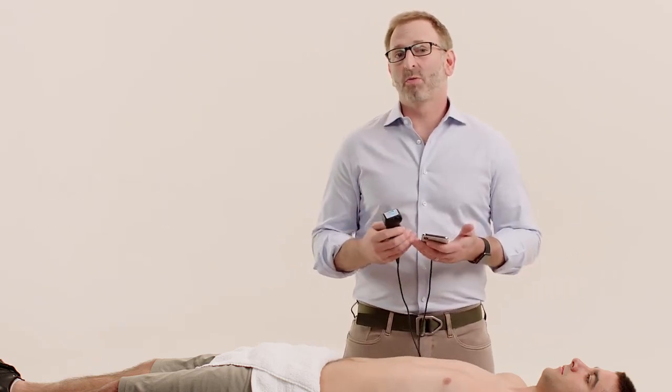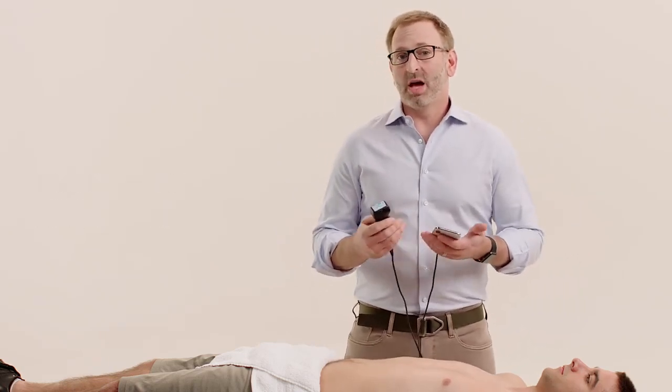I'm Mike Stone. I'm an emergency physician and a point-of-care ultrasound specialist, and I'm going to show you how to perform an extended FAST exam with the IQ.